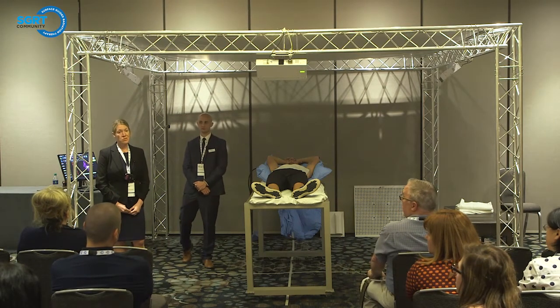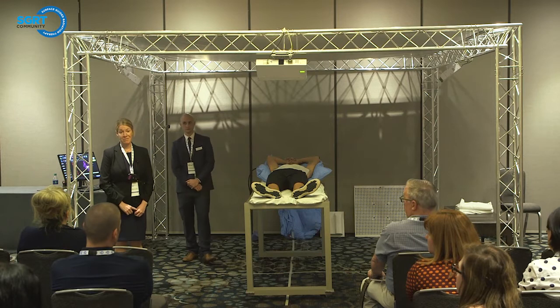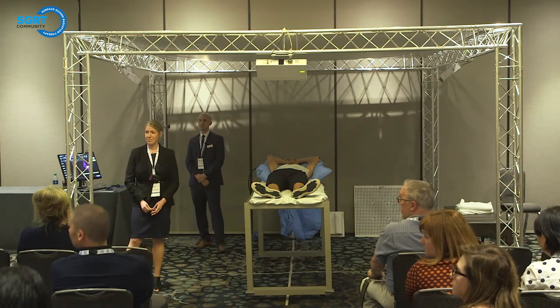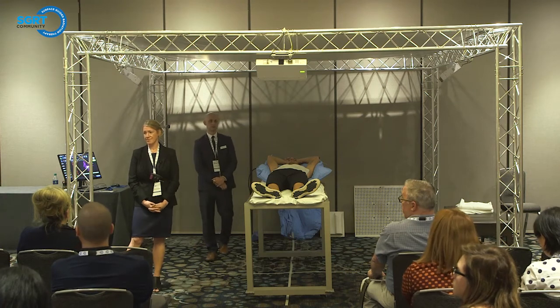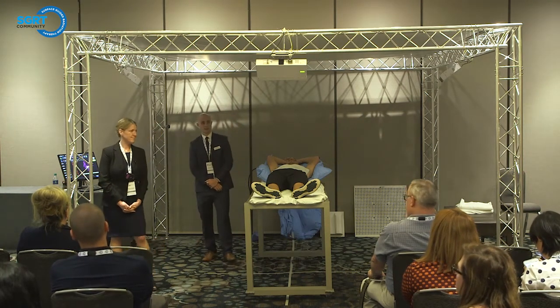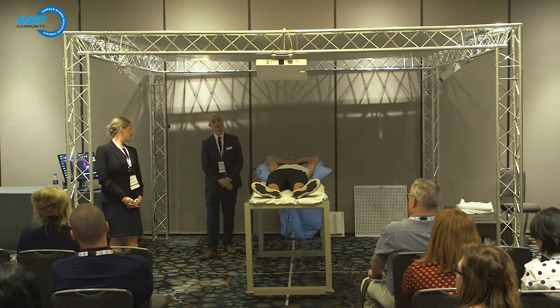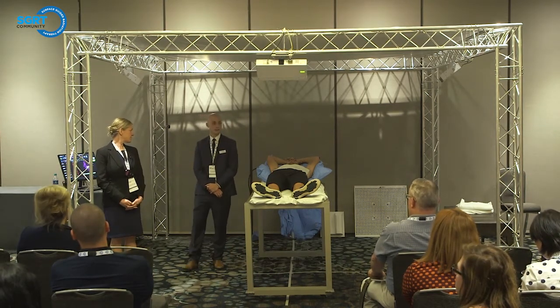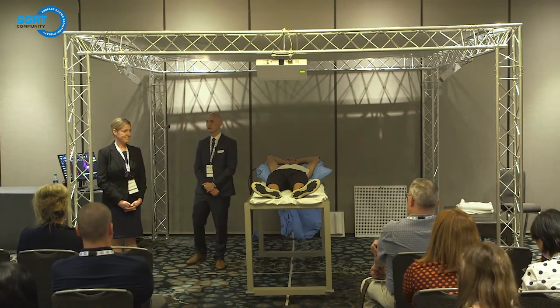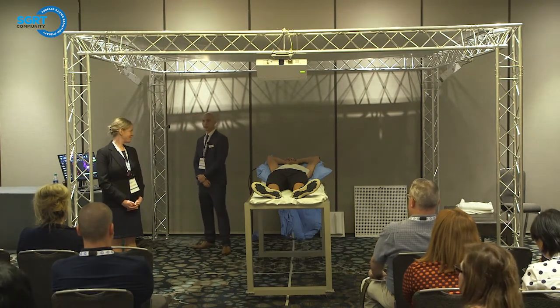Will it only affect the dark skin tone? So you change it per skin tone. Another thing that can affect that is your lighting levels. Make sure when you're doing your calibration that your lighting is the same for your calibration and your actual treatment.